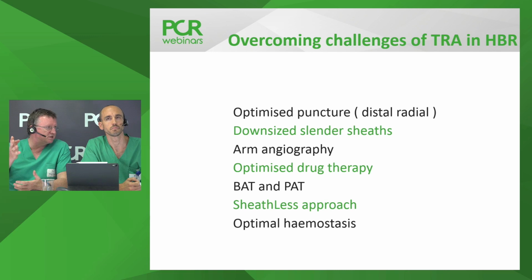It wasn't necessary in this case, and for very experienced operators, I don't think it's necessary. But if you're earlier in your learning curve, shooting an arm angiogram will alert you to loops and tortuous segments, if you have any trouble, any resistance. So, if you're further on, I think it's entirely appropriate to not do an arm angiogram, but earlier on, I would shoot it in everyone.